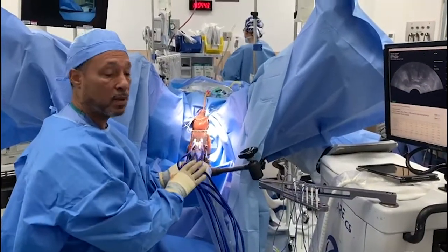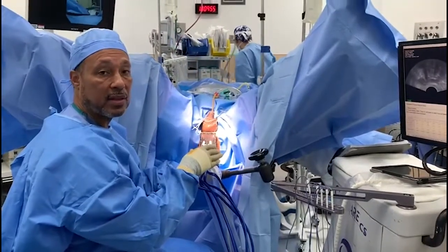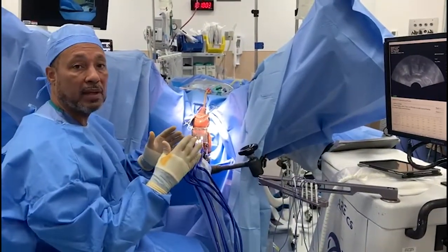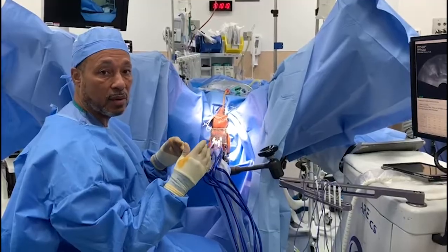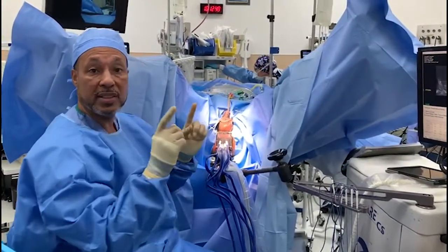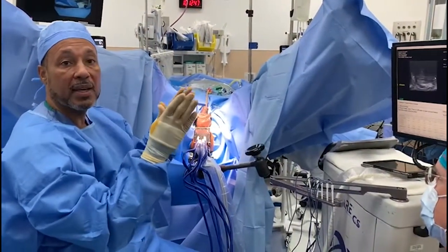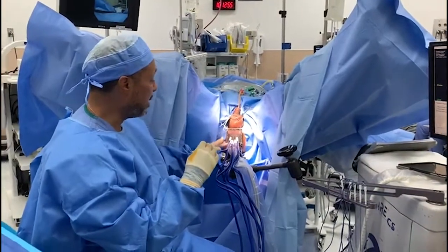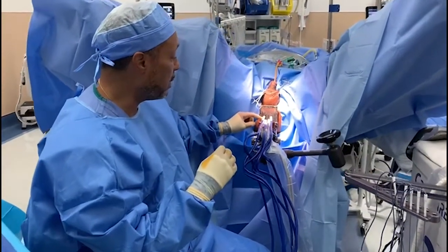Another advantage is that I have a foot pedal here that can help me toggle between transverse and sagittal, so my assistant doesn't have to keep going back and forth. I'll toggle many times under real-time to make sure the freeze process is precise. I have my assistant redo the length measurements because the prostate can get compressed when placing the probe. We set five centimeters for the mid-gland at the start, but now with the probes in, it went down to 3.9 or 4 centimeters. I do all lengths for all three probes on each side to get my proper length.